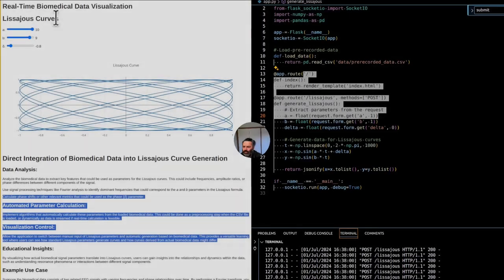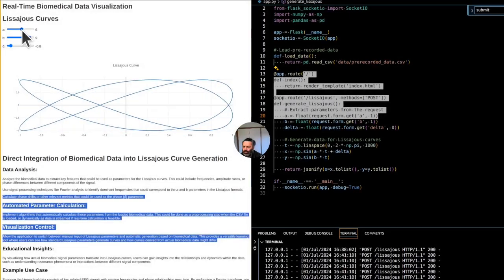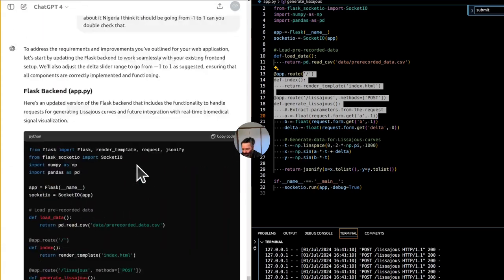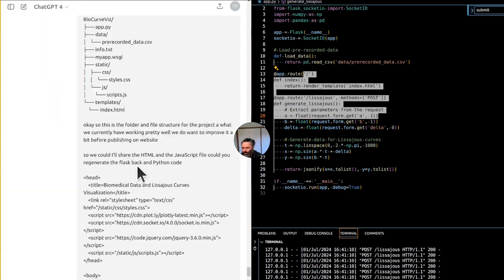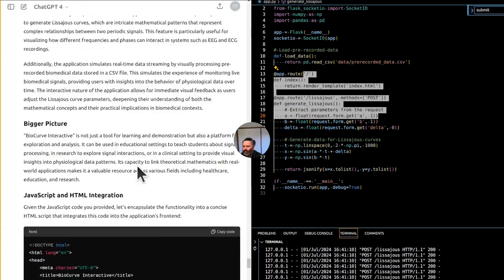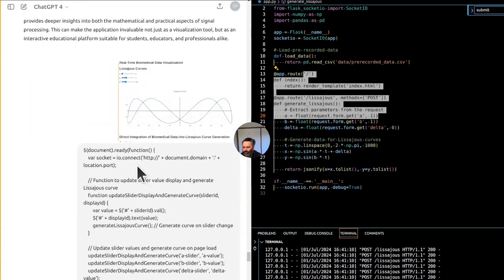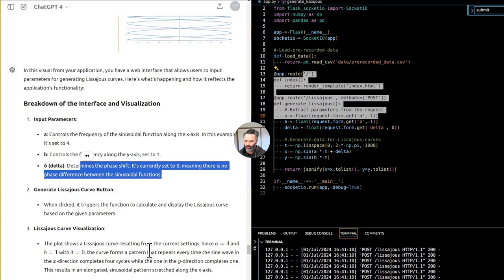Research and development. Data collection and analysis. Use the application as a tool for collecting and analyzing data in research studies. Researchers could use the visual feedback from Lissajous curves to hypothesize relationships in biomedical data and test these hypotheses through further experiments.